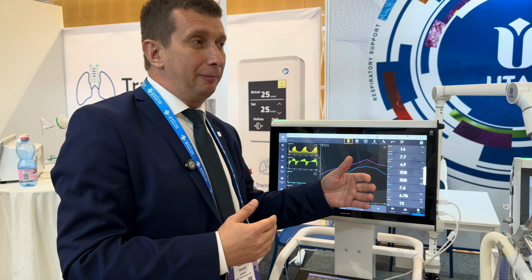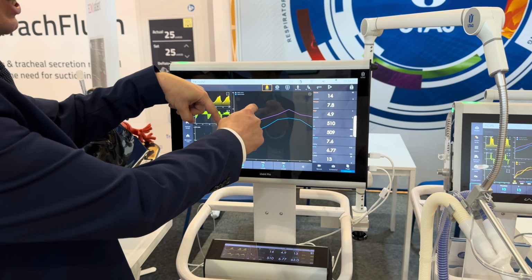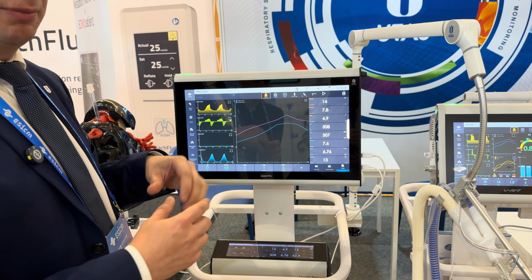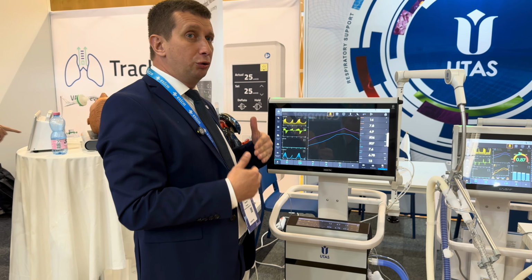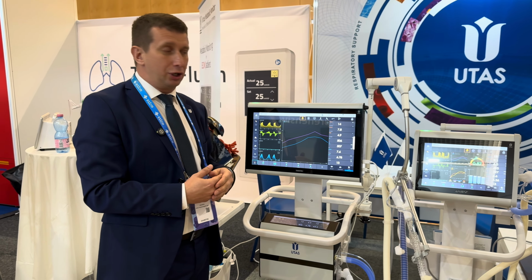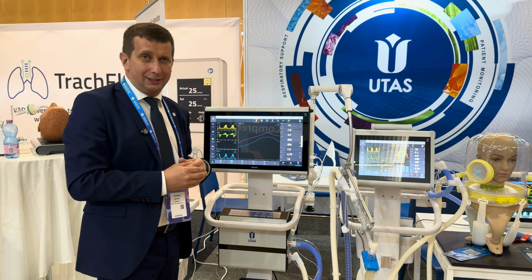to provide the proper feeding strategy for a patient, because underfeeding and overfeeding is a huge problem for a patient in the ICU in terms of prognosis for the patient's life, in terms of death prognosis for a patient. So it's very important for clinicians to track the energy expenditures of the patient, because depending on the progress of the pathological process and the actual feeding strategy, it can meet demand or can be underestimated or overestimated.